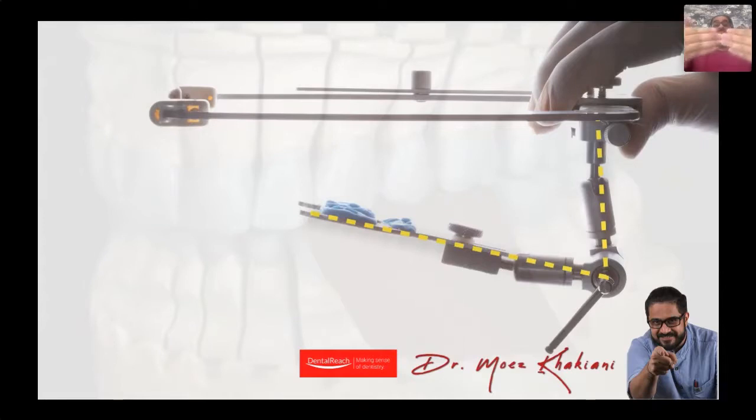It tells me how far forward or backward the maxilla is placed. Class 1 maxilla, class 2 maxilla, class 3 maxilla. Because remember, unless you have a stable maxillary relation, there's no way you'll be able to relate the mandibular cast correctly. So maxilla is fixed to the cranial base. So we use a Facebow to give the orientation of the maxilla on a semi-adjustable articulator.